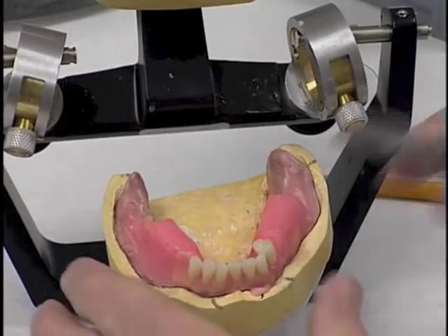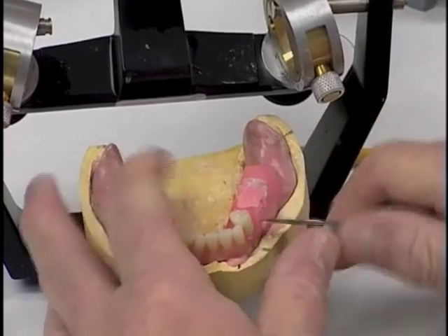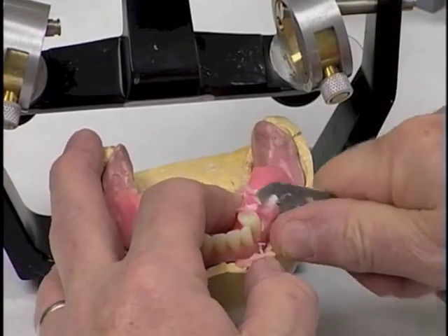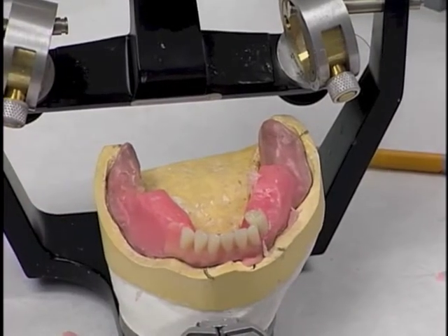Now we're going to pull wax for the mandibular first molar. We're going to remove enough wax so that we'll have space in there to place the tooth. Pull the wax again.